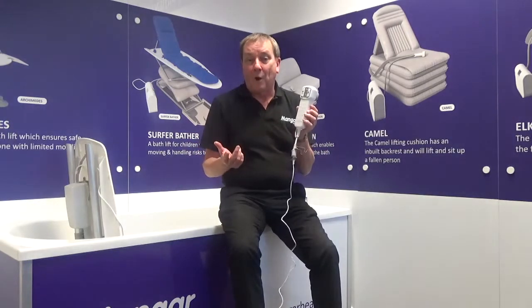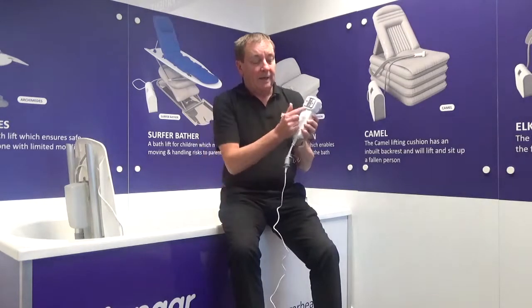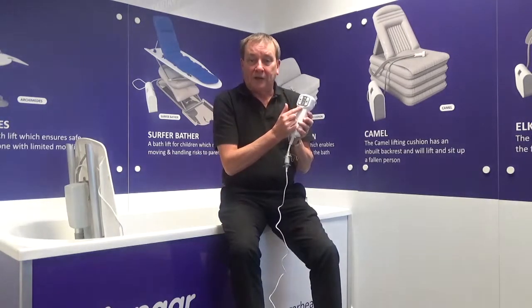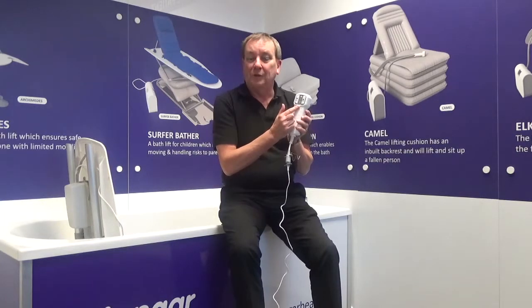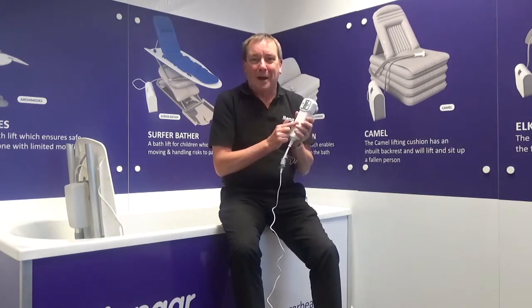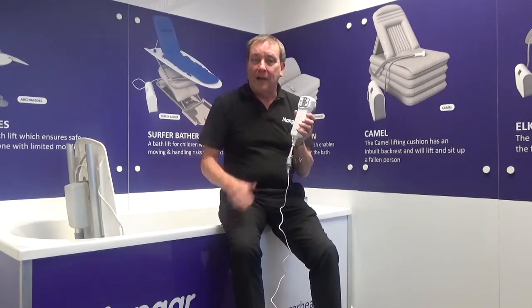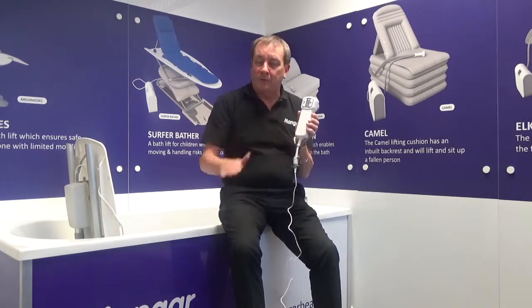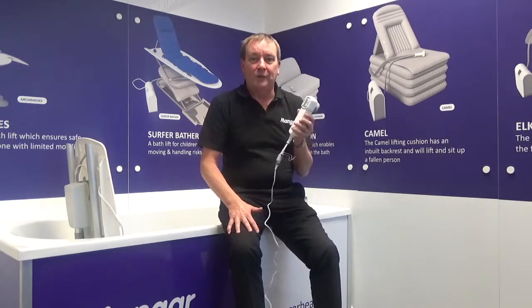Don't worry about overcharging the battery. It's impossible to overcharge it. The indicator will flash when it's charging. When it's fully charged, the light will be on solid. You cannot overcharge it. As an extra safety feature, we've built something into the battery that says it will not take you down to the bottom of the bath unless there's enough power in here to bring you back up again. So please, please, don't ever worry about being stuck at the bottom of the bath.